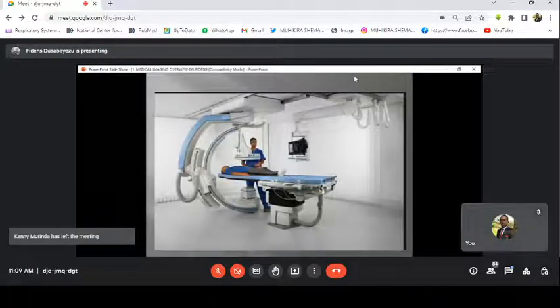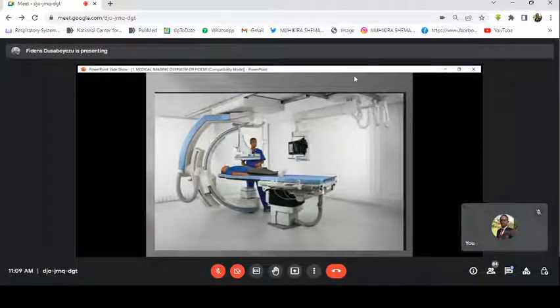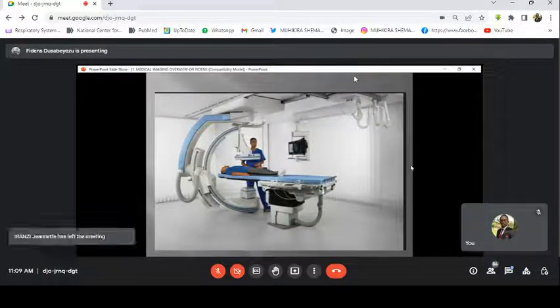So this is an example of a fluoroscopic machine. Can you see? Even the operator, the technician or the doctor, is within the field of X-rays. He's with the patient. Now, can you see that the operator is looking somewhere else? Now he's looking at the screen and imaging the abdomen, seeing in real time what is going on within the abdomen.